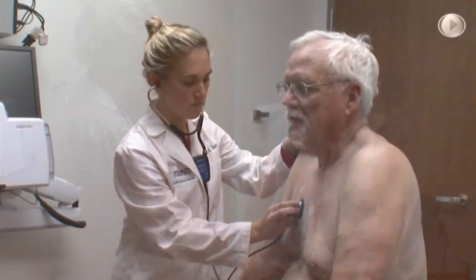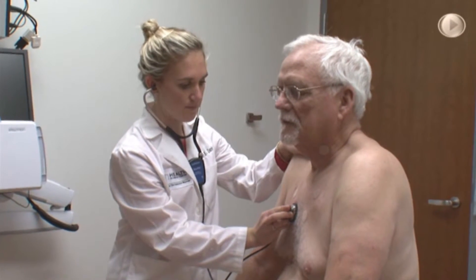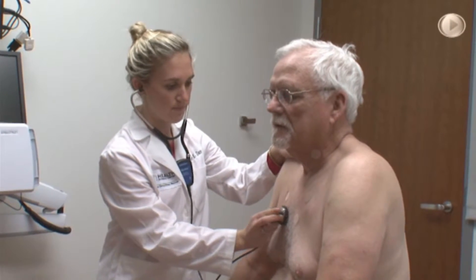With simple one-on-one student-patient interaction, it is an ideal tool for use with any standardized patient and OSCE program.